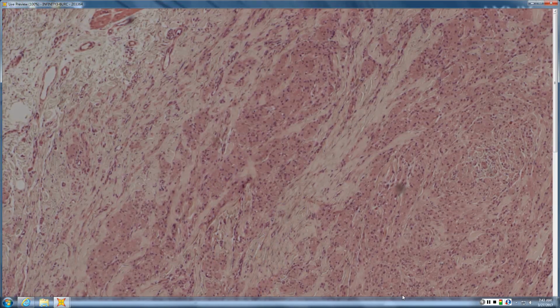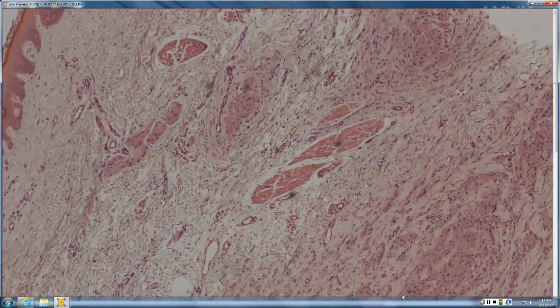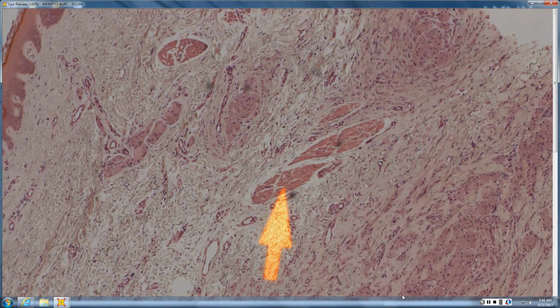So granular cell tumor, the first thing is the color. It matches the color of the erector pili muscle. It's usually pretty much right on what erector pili looks like in color. And because they occurred in the tongue and they were the same color as muscle, the old name was granular cell myoblastoma because they thought it was a primitive smooth muscle tumor.